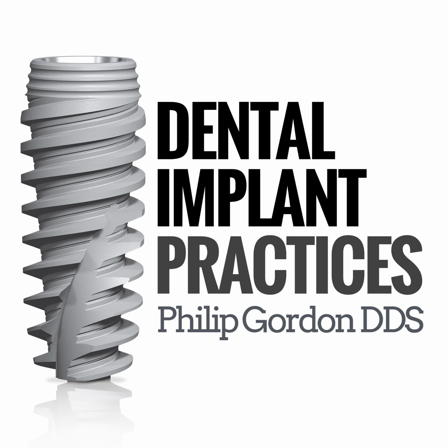And the surgical guide is produced either in Germany or in the U.S., or I actually have a 3D printer in my office, so I print out a lot of my own surgical guides. And we generally get the case back within a couple days, and we're ready to go and get the patient in for their surgery. So it's a really easy workflow.